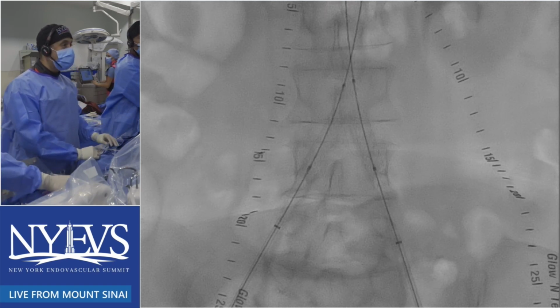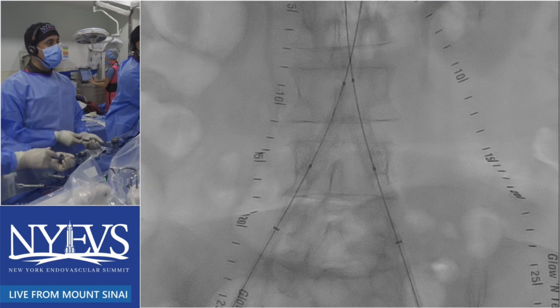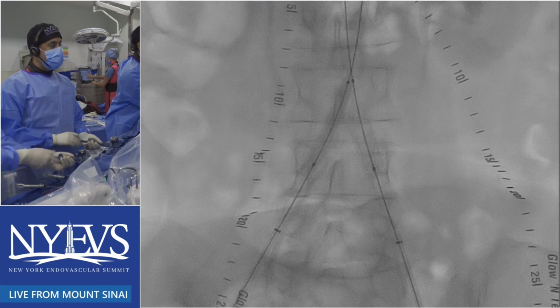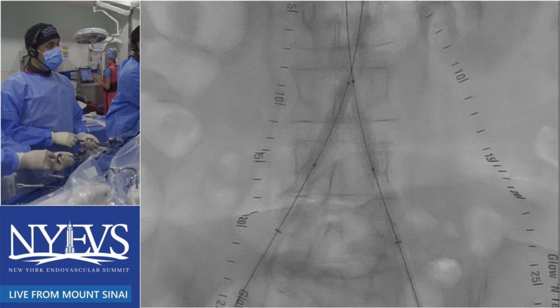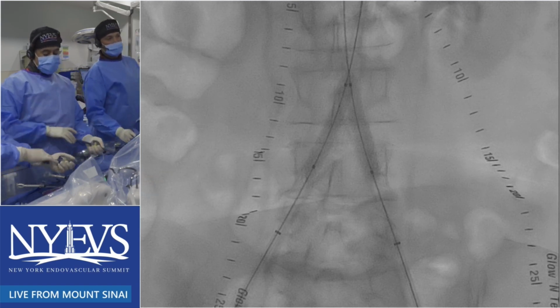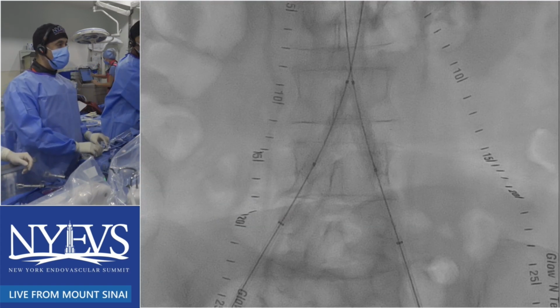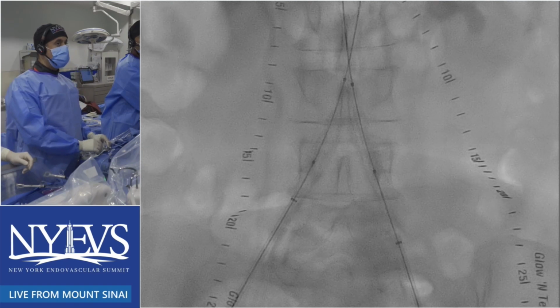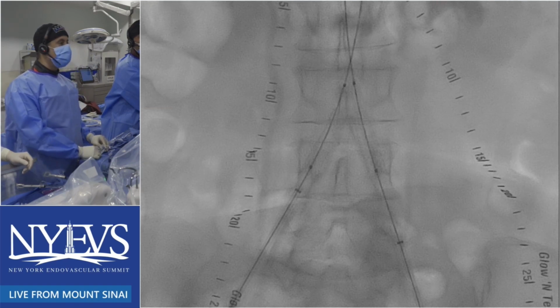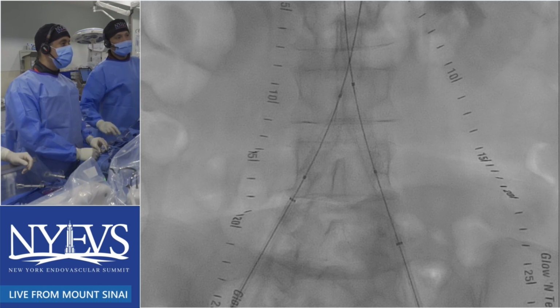And the sizing of the balloon, will it be determined by the size of the distal aorta, or do you just size it according to the stents? I'd size it based on the stents. The other benefit of doing this advancement in post-dilation is you can be much more aggressive without worrying that, with your shoulder on the distal end, you're going to create a distal dissection. If you were worried about that, you would probably need a containing stent above. So in this particular scenario, that's not going to be necessary.